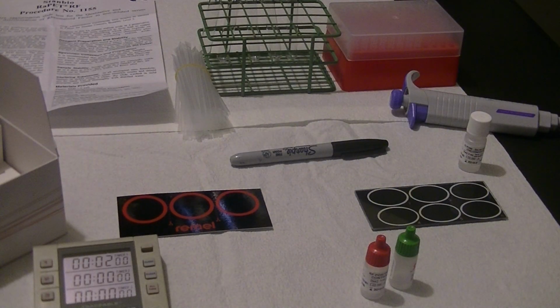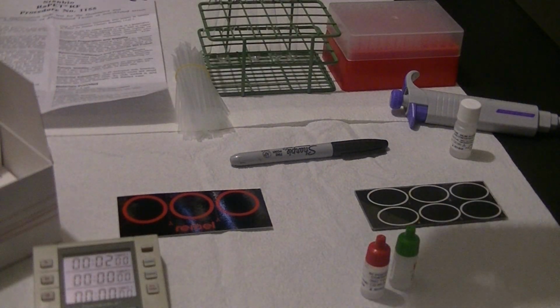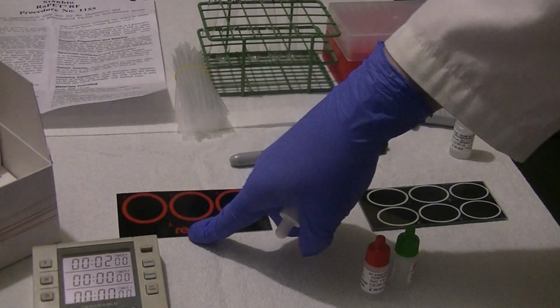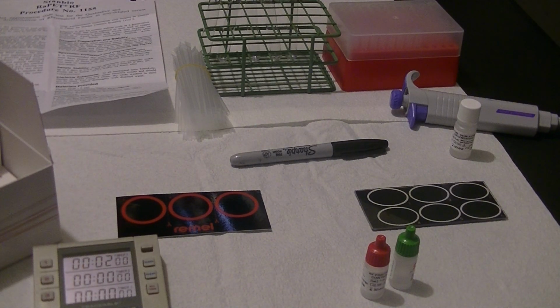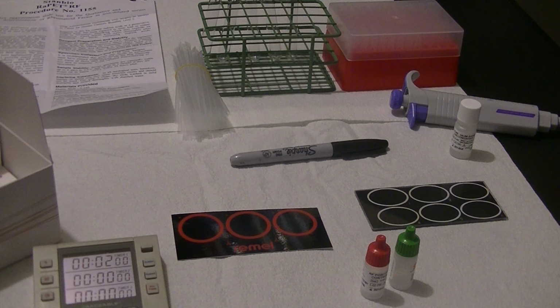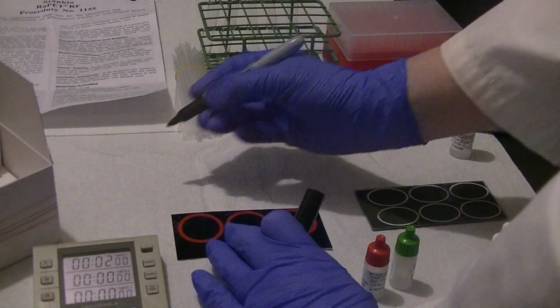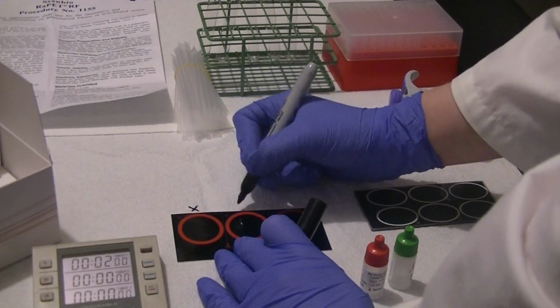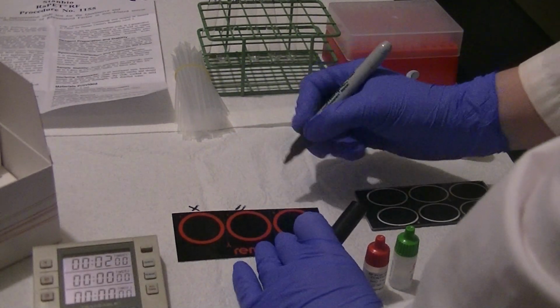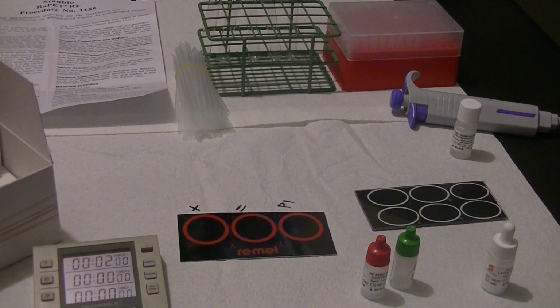Because the particle used in this test is a latex particle, which is white, the testing card that we use has black circles on it so that the latex particles can easily be seen when they clump. Also, because this card is black, it's hard to label the card using a marker. So what we normally do is label where we've put the positive, where we've put the negative, and where we've put our patient. And today we have patient 1.